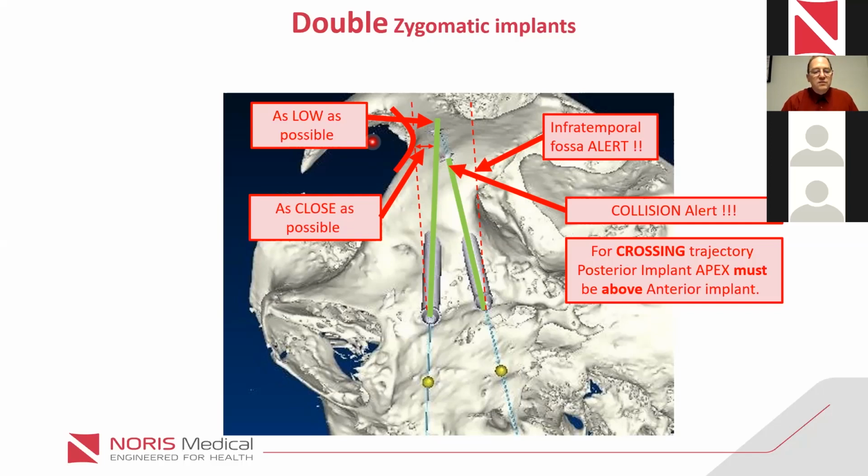But look what happens. Oh, I don't have this slide here. Just a second. Basically, if you look at this slide, the distance from here, or from here, or from here, there are different implant lengths. You see? Let's go back here. You see where I'm putting the dot where the green implant is now.